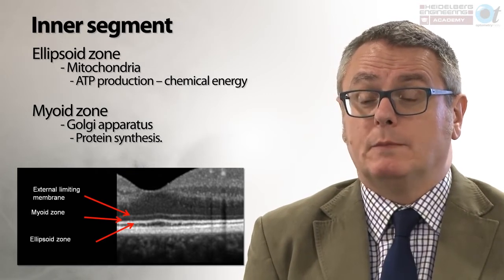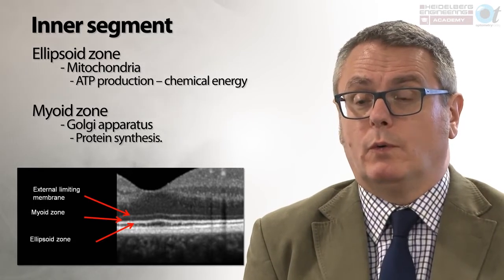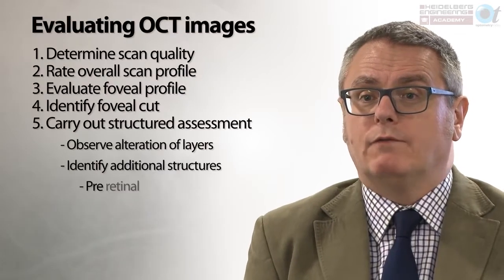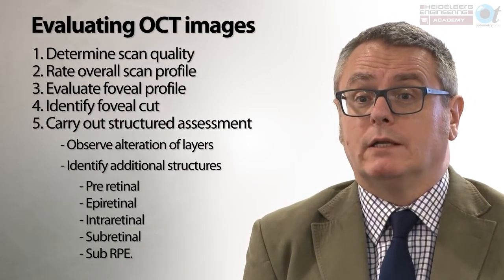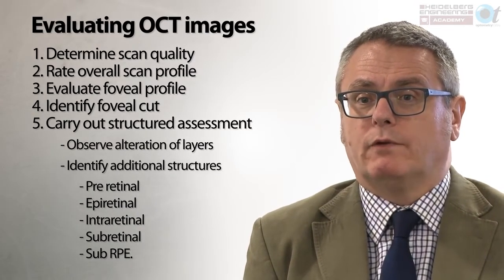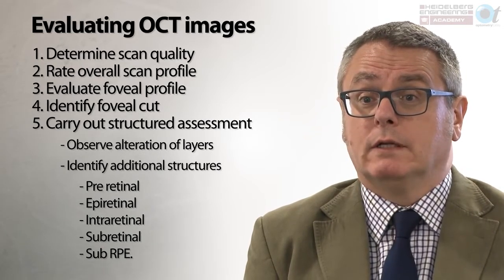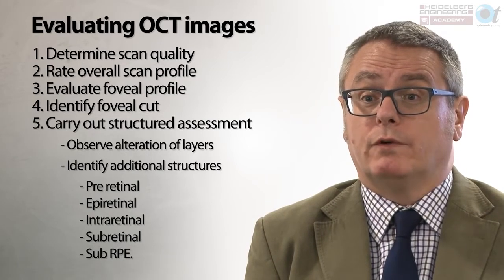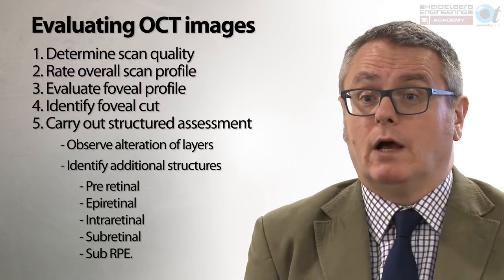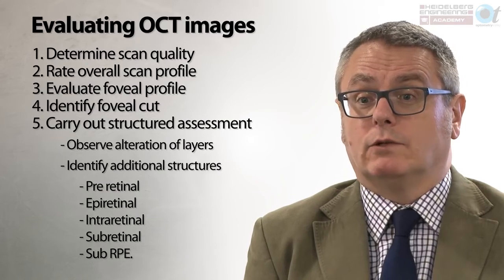Disruption of the external limiting membrane can also significantly impact the patient's vision, so it is always important to comment on those structures. When evaluating OCT images, it's important to follow a consistent, repeatable five-point process: look at the scan quality, rate the overall appearance of the scan, evaluate the foveal profile, identify whether or not the fovea has been assessed within the scans, and then carry out a structured assessment commenting on alterations to normal retinal layers and identifying additional retinal structures.